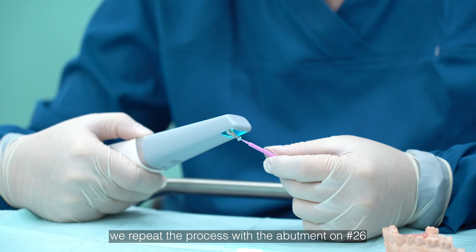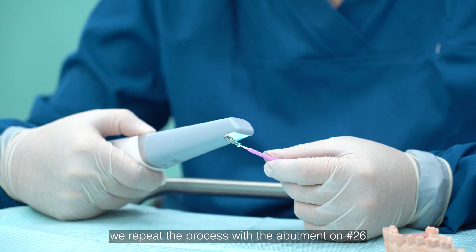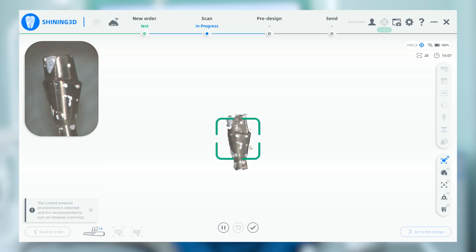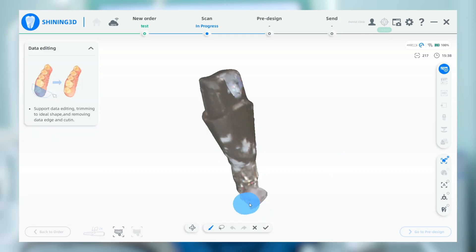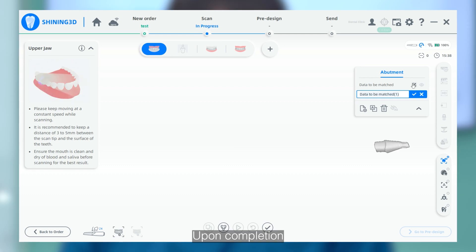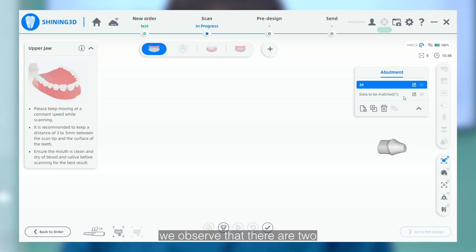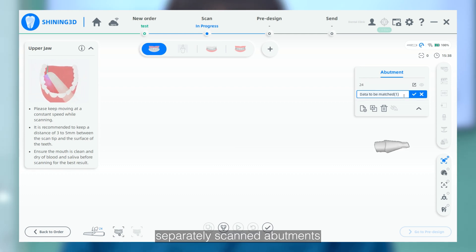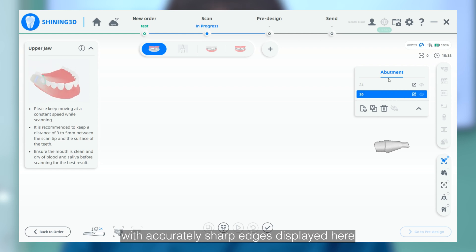Following this, we repeat the process with the abutment on number 26. Upon completion, we will observe that there are two separate scanned abutments with accurate sharp edges displayed here.